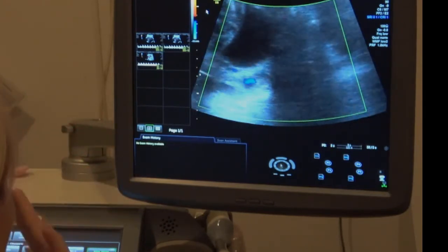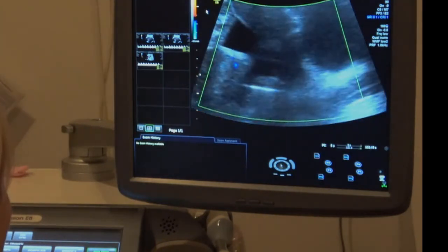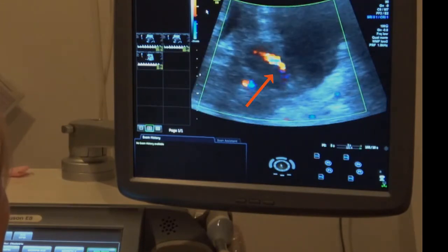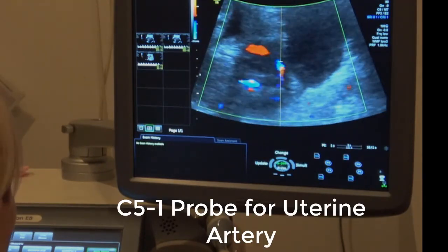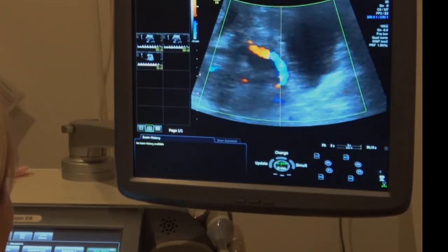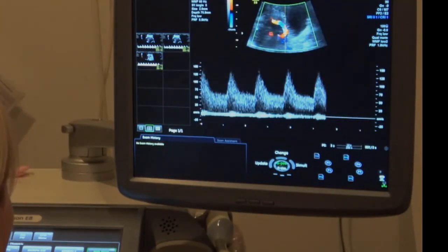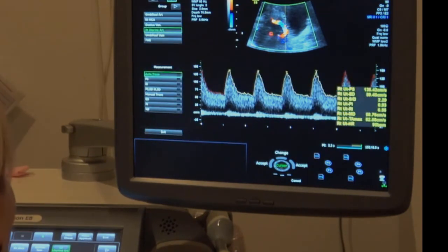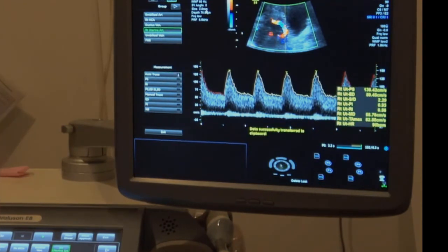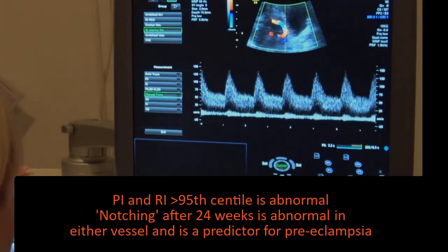And then that was just midline out to the left, laterally, swinging out. And the right one, just there. So it has helped to use that different probe. There it is. And if for some reason you've got a bunch of noise and you can't get a nice trace, you can just do the manual trace yourself. Again, I just do one.